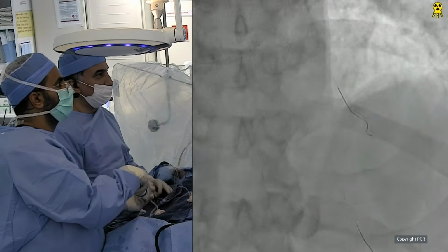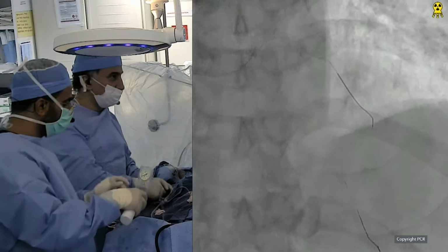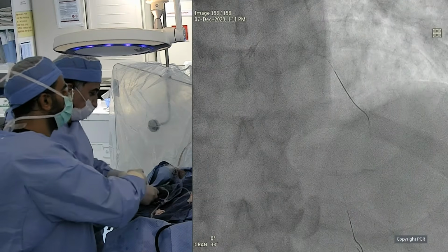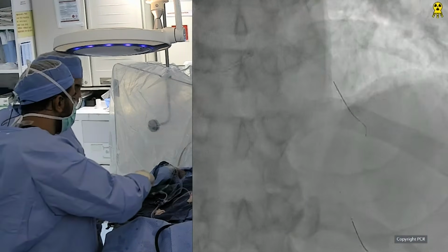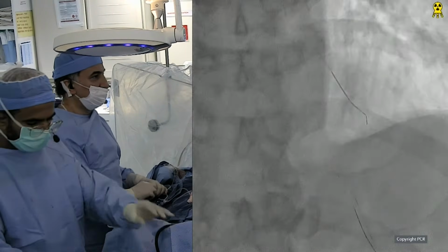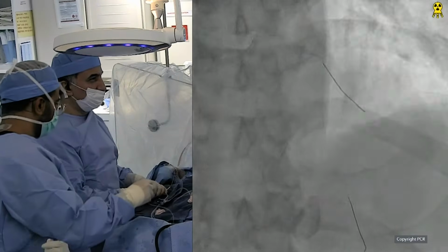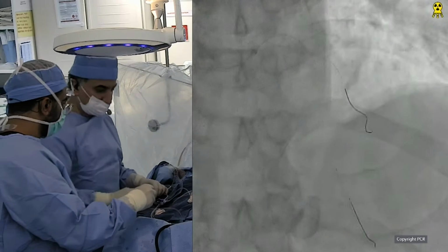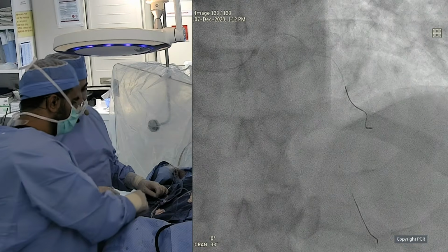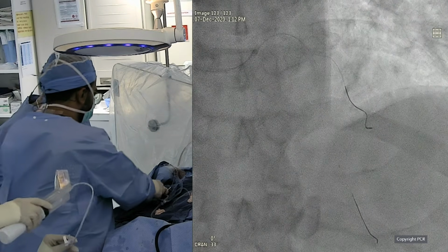Thank you. Just one quick question to Julio. Any role for orbital atherectomy here? When it's so tight and so unpredictable, so small, in my own limited experience with orbital atherectomy, when I see nothing passes with that critical stenosis, I think I will do what Hussein has done. I'll go to rotational atherectomy, especially for a long calcified lesion like this one.